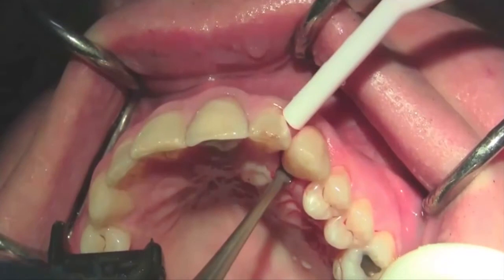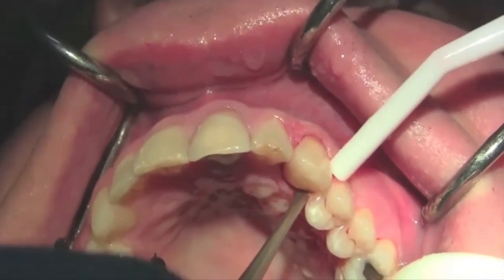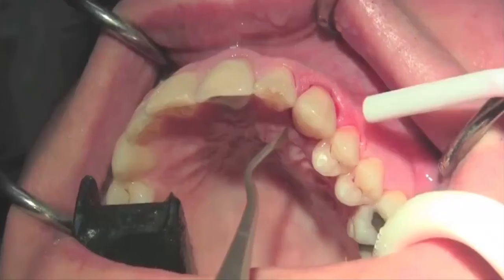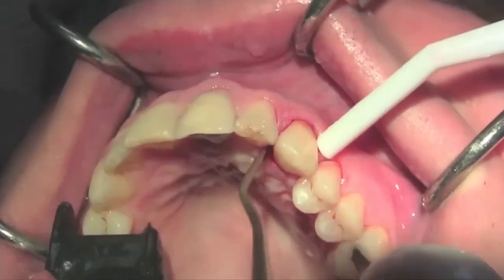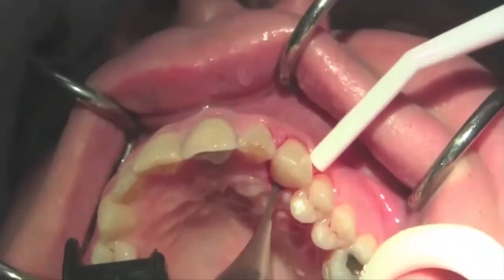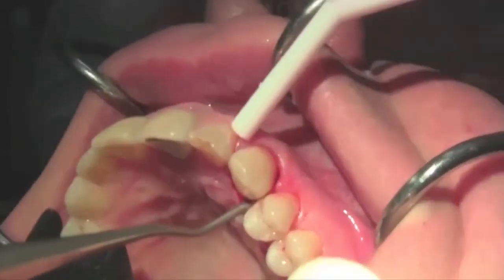The tips that you're going to see next are going to be the PDL luxator kit, which are devices built specifically for atraumatic extraction and are distributed by Salvin Dental all over the world. They have different tips with different designs, and the important thing is that you're going to try to follow that initial preparation that was done by the piezo device, by the piezo tip.